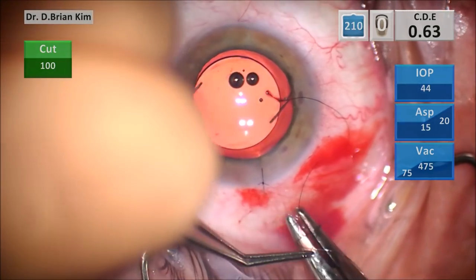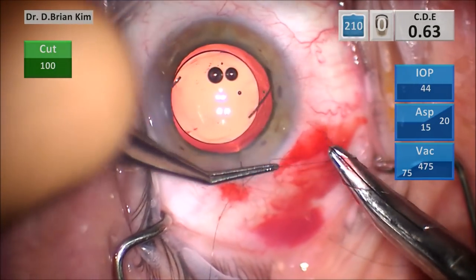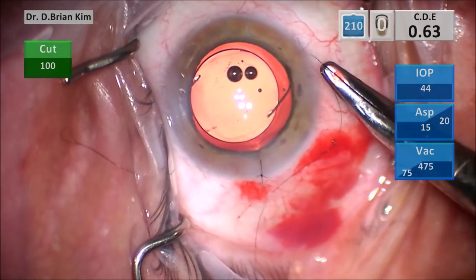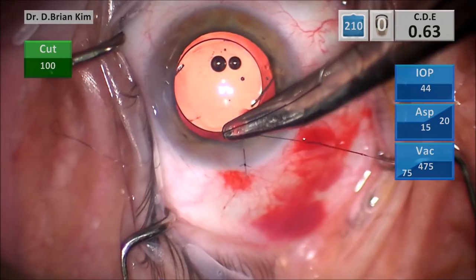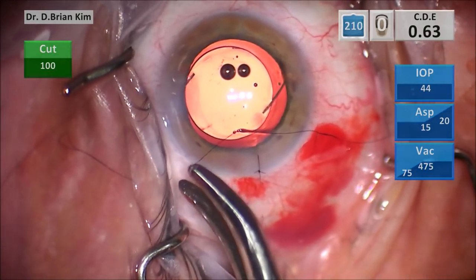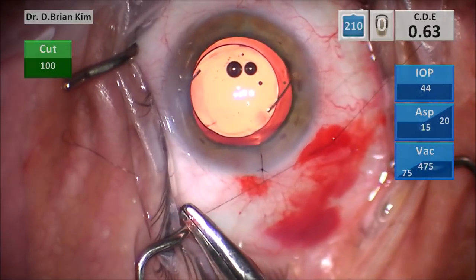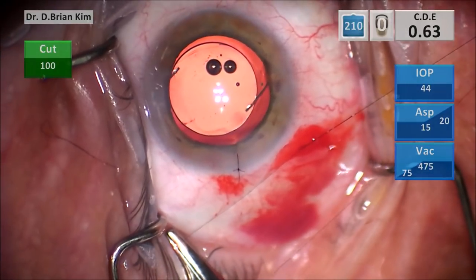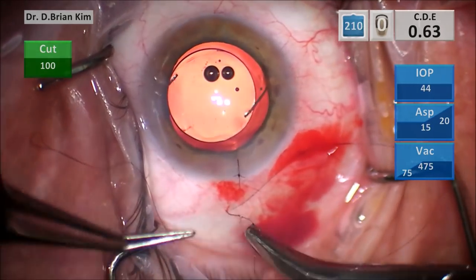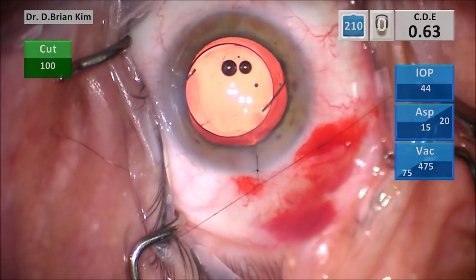And so the take-home points are: don't let the chamber collapse when you have a posterior capsule rupture. Early identification is critical, because if you keep chugging along thinking things are fine, then that's when you're going to have a whole lot of vitreous in the anterior chamber. As you could see, I didn't have very much at all, and the hyaloid face was intact in the very beginning when I recognized it.